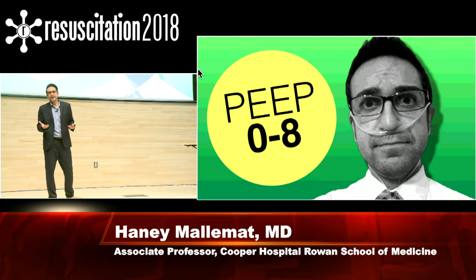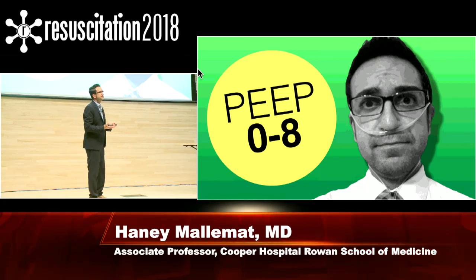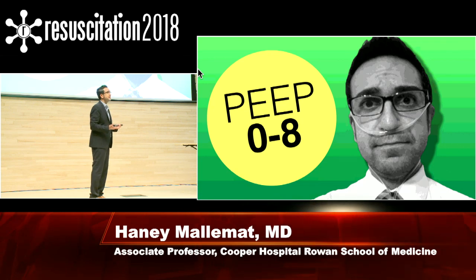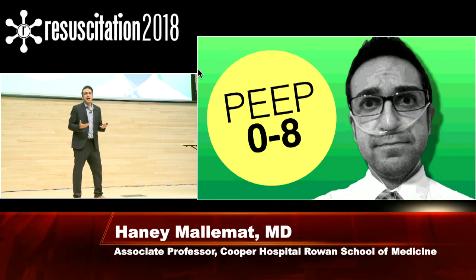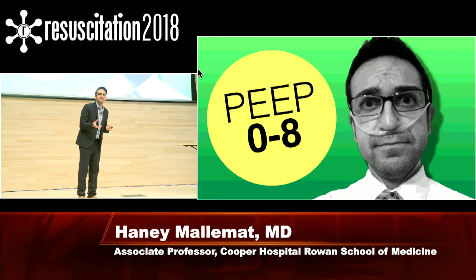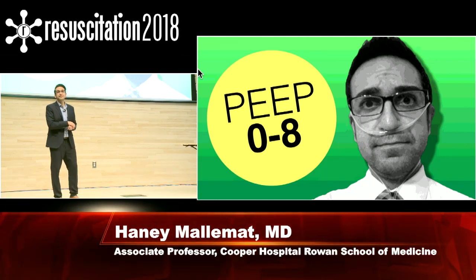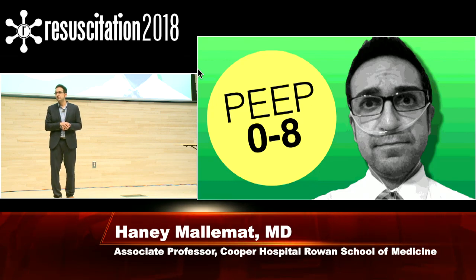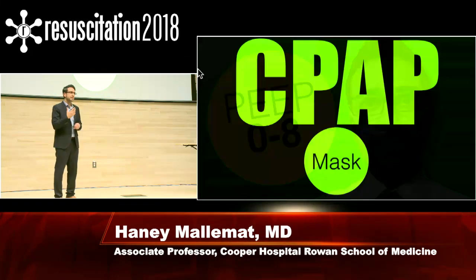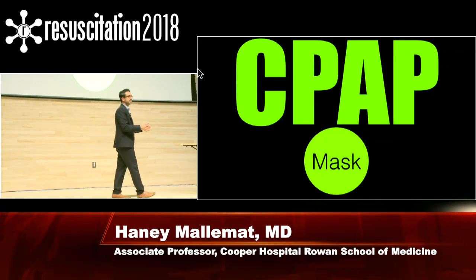Now, what PEEP do you get? No one really knows. It's anywhere between 0 and 8 centimeters of water, based on the studies you read, and based on the patient habitus, how much soft tissue they have in their oropharynx. But I call this diet CPAP. If you're looking at somebody and you're like, yeah, they should get a tight-fitting mask, but they're not quite there yet, try some of this. This will help some of those patients out. Not all, but it's just kind of in between using completely nothing and using the tight-fitting mask.